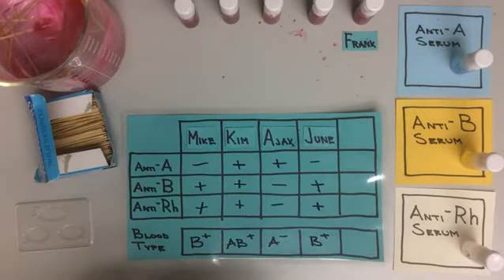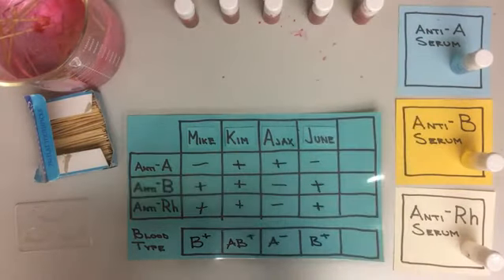Our last sample to analyze is going to be Frank.